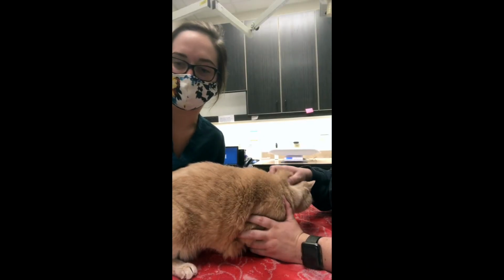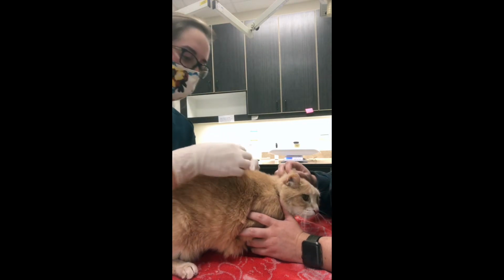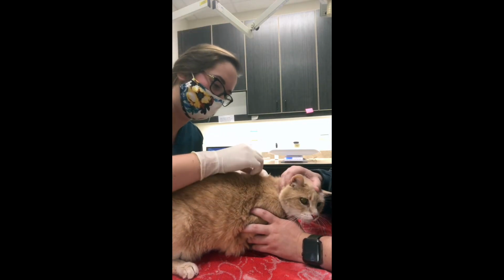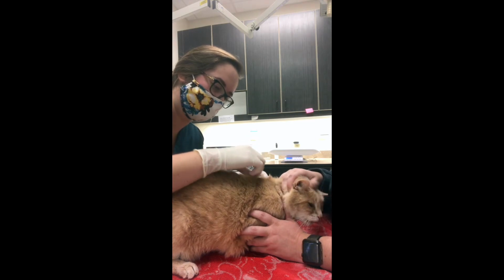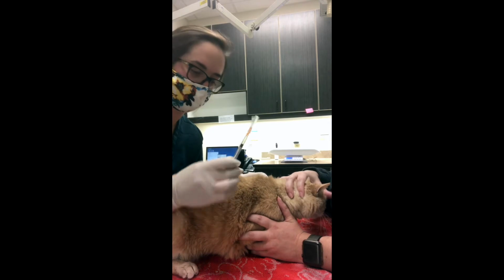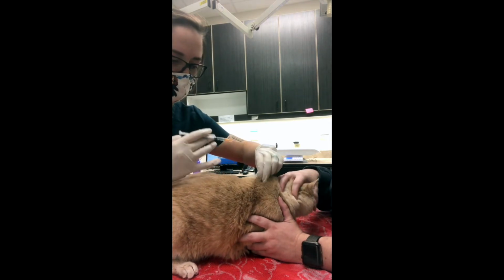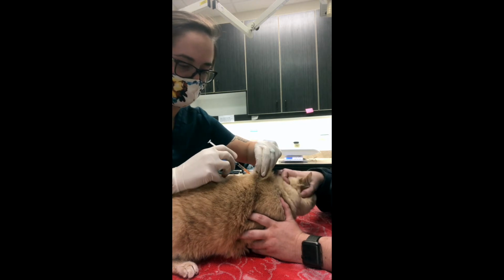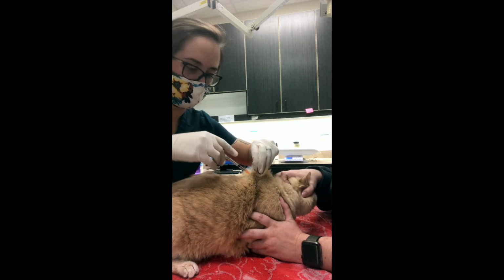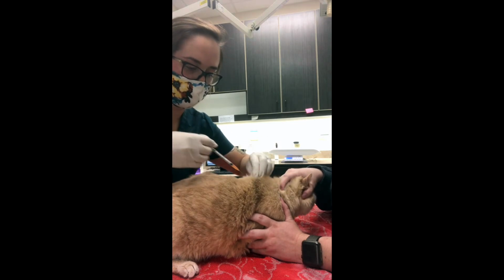So I'm going to do a sub-Q injection on this cat here. We're going to go ahead and prep the area with an alcohol swab. We have her injection drawn up. We're going to tent her skin, insert the needle, draw back, and inject.